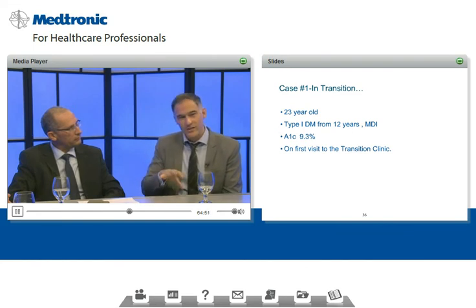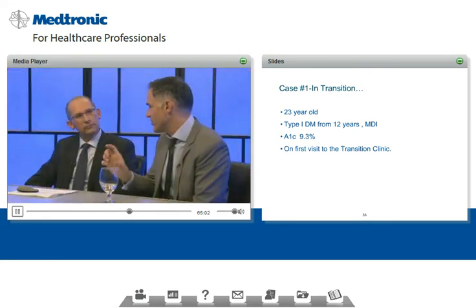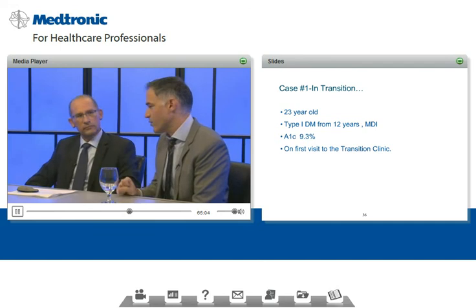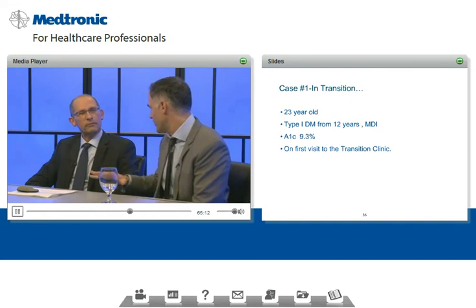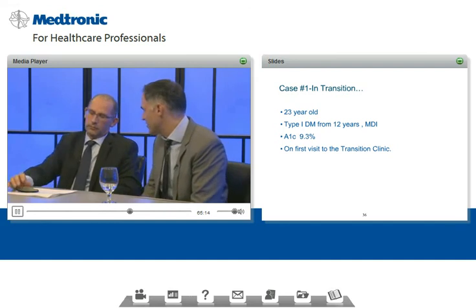But I kind of realized as you went through this, we do need to remind our patients one step at a time. Think about your basal, evaluate it as well as you can, find those opportunities in a day when you're not having meals, and compare two sugars, are they rising or falling? That has to be taken care of before you can really do a great job at the bolus parameters. It's got to be a step at a time, doesn't it?